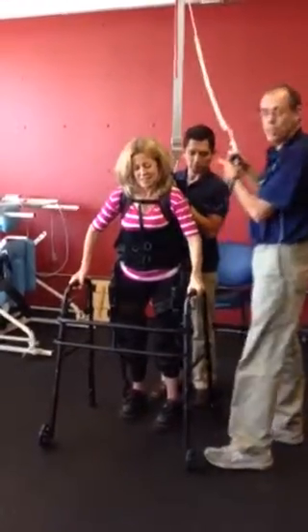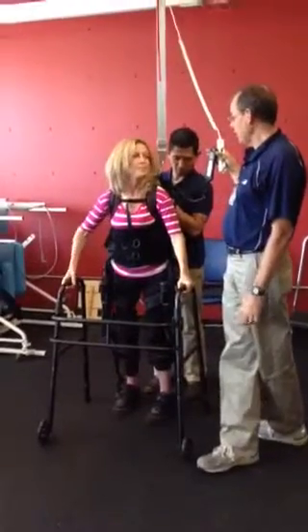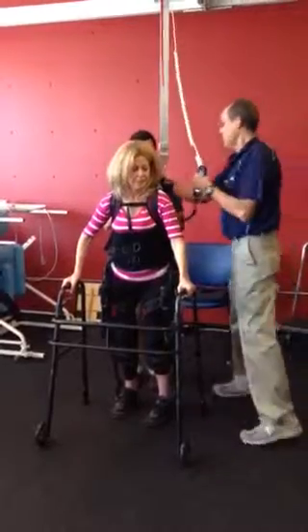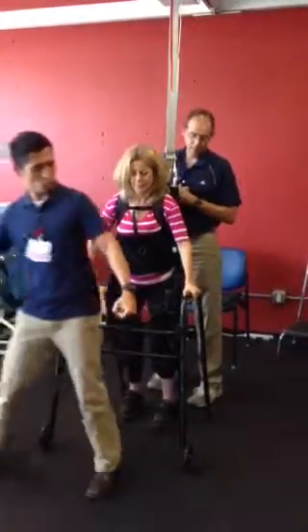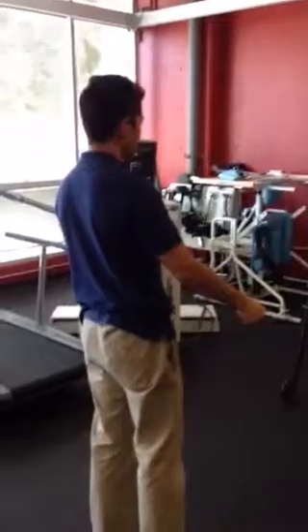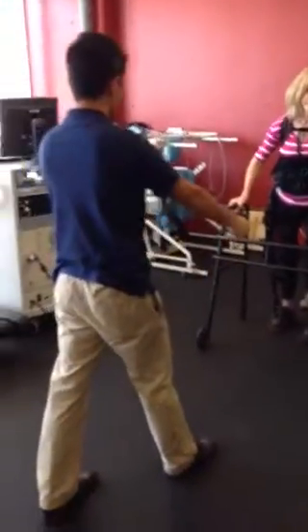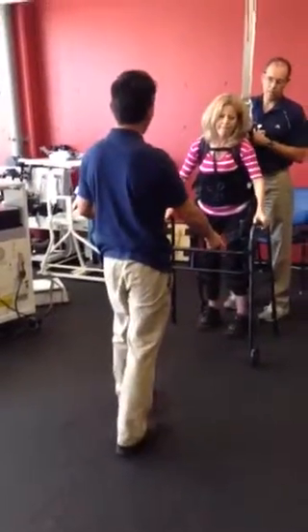If anything's spasming or hurting, let me know. We got you — you're not falling. This will not swoop away from you. So you're a walker — I'm going to face you. When you first start, it's just leading like this. And when I say step, I'm going to do this. Once you get here, it goes: walker, then weight over your body, and then step.